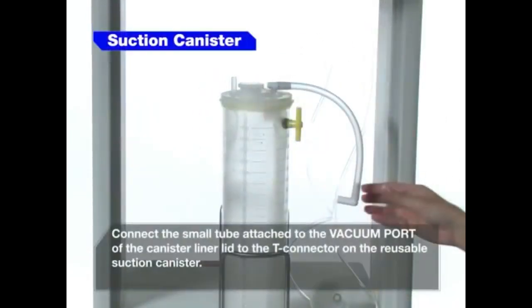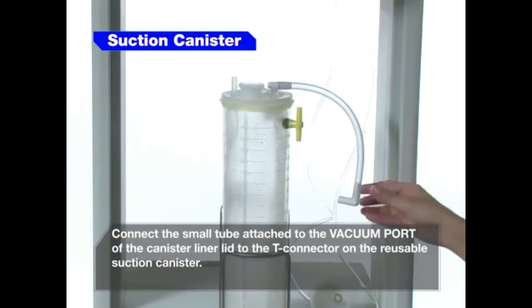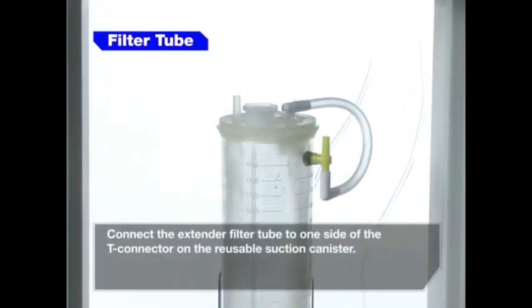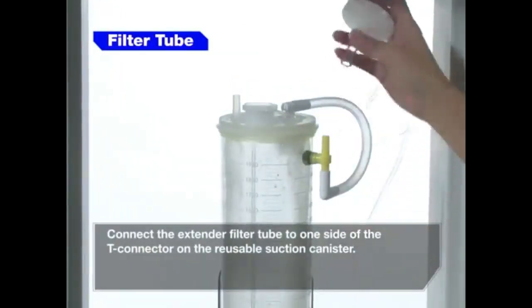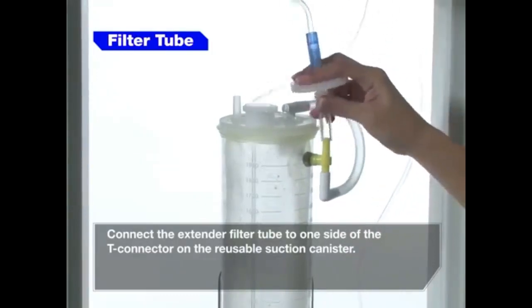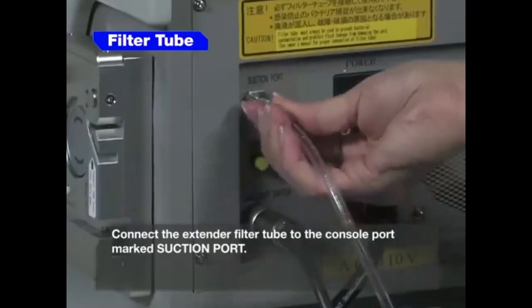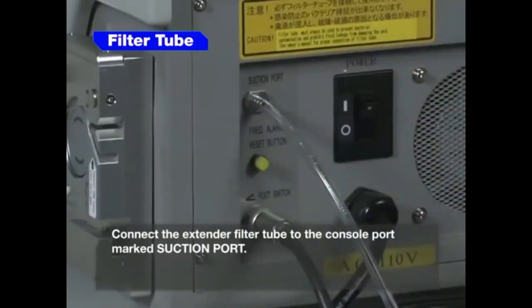Connect the small tube attached to the vacuum port of the canister liner lid to the T-connector on the reusable suction canister. Connect the extender filter tube to one side of the T-connector on the reusable suction canister. Connect the extender filter tube to the console port marked suction port.